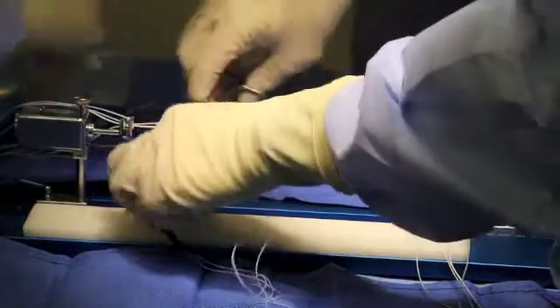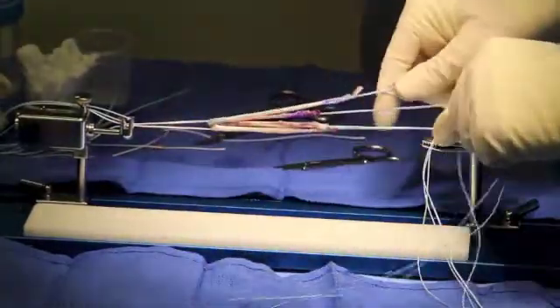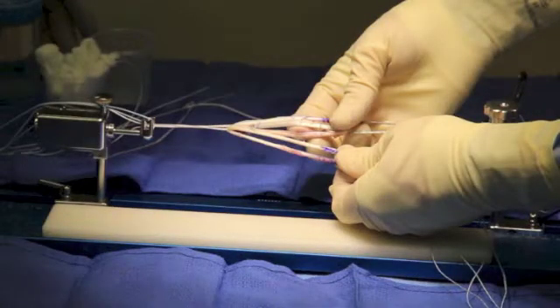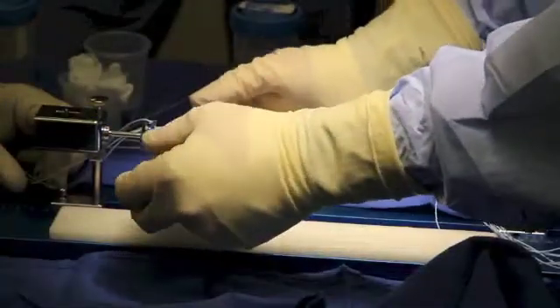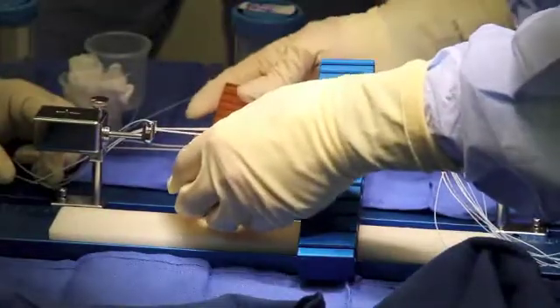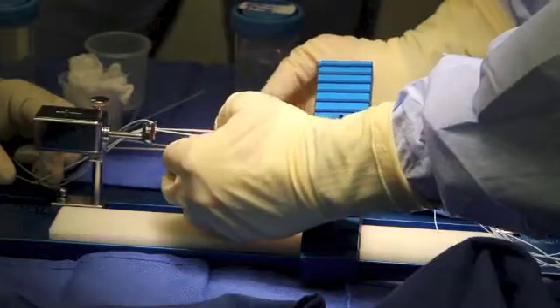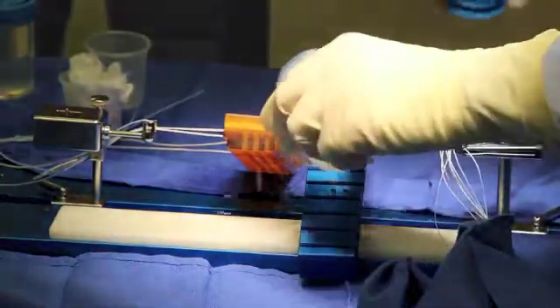Finally, the gracilis is added to this construct, passed through the cinching loop, folded and secured. There we have a five-strand construct. The graft is tensioned and the individual ends are measured, which may differ in size. The five-strand hamstring autograft for ACL reconstruction is now ready to be passed and covered until use.